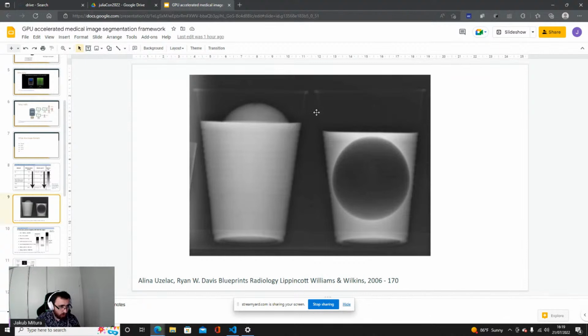Each point will usually, not always, be a floating point number or integer that gives the value of this particular property in a given spot. So in a given spot we have a given radiolucency, that is, how easy it is for some types of radiation to get through.